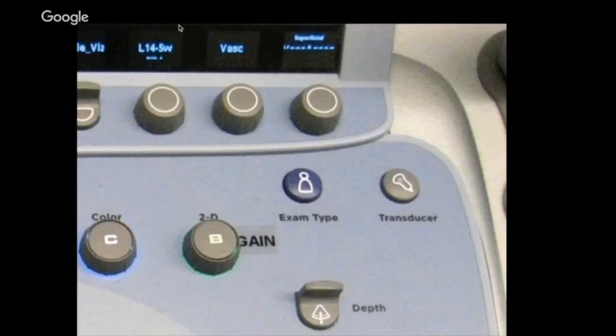I talked about how there was A mode ultrasound, which didn't produce a visual image. So when they made grayscale, like, hey, there's an actual picture of what's going on, they call it B mode. We're stuck with all of this bad language, right? Turn up the B mode gain. Just turn up the gain. And then you'll see also the button for depth. So everything that you really need to start driving is in that upper right corner.